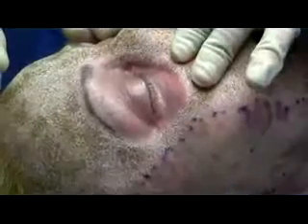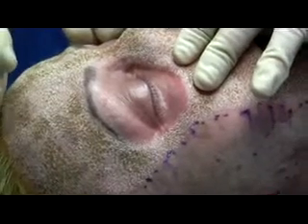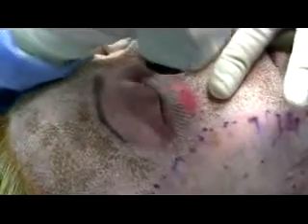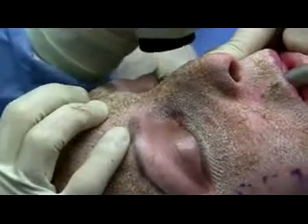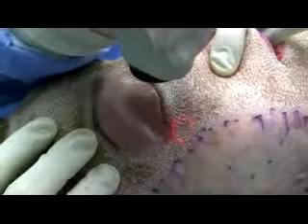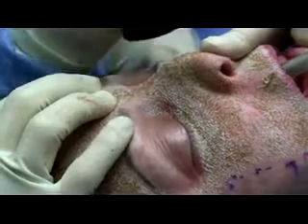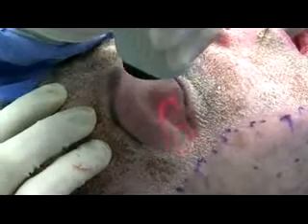Passes at 100 and 6, which is very aggressive. It's as high as this laser will go. The eyelid skin is thinner, so we're going to do a single pass here of 80 and 6. I'm going to do the same thing on this lower lid. Now we're going to change our settings and come back. One aggressive pass at 80 millijoules and a density of 6. Now we're going to do a second pass at 70 and 5. Now we're going to drop to 60 and 5. And we're going to do a single pass on the upper lid.